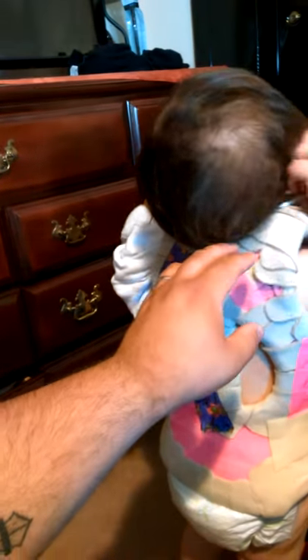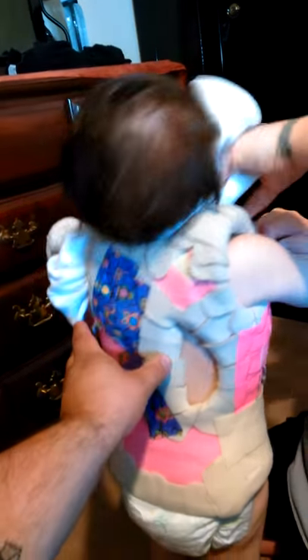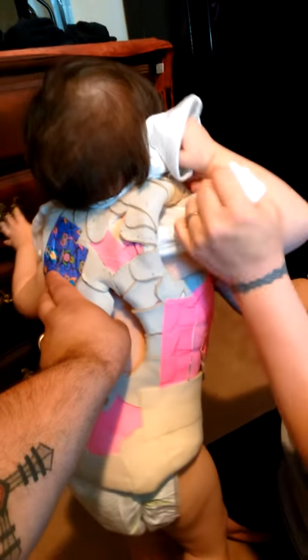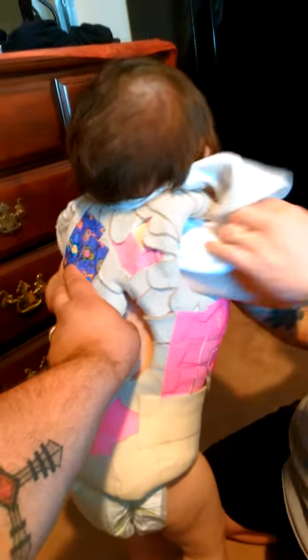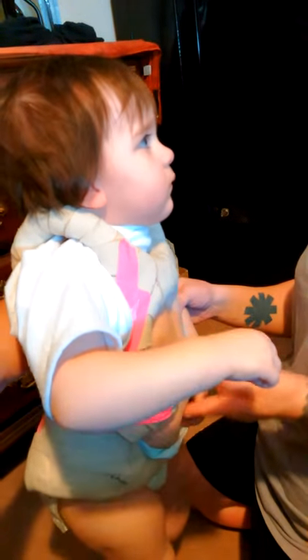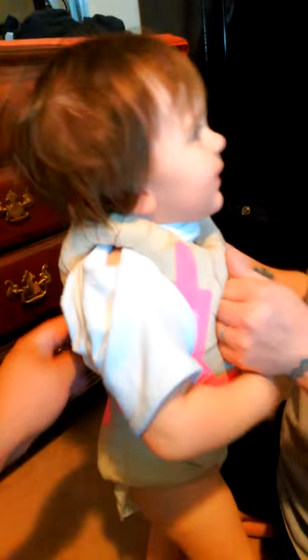Here's the other shoulder — see, it's kind of bunched up. Just find the bottom of the shirt and tuck it through. The other thing with these shirts is if you pull on them way too hard they stretch super easy. This is probably the hardest part — getting through the arms.